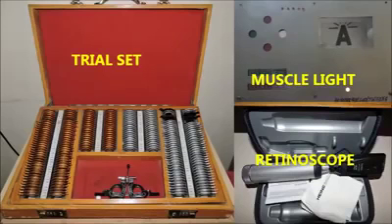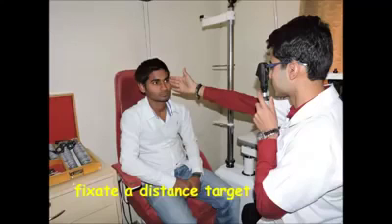For performing retinoscopy, we require a trial case, a target and a retinoscope. We ask the patient to fixate at a distance target so that the accommodation of the patient's eye relaxes. The procedure is performed at an arm's distance, known as the working distance, and the conversion of this working distance into diopters will give us the power of the working lens.